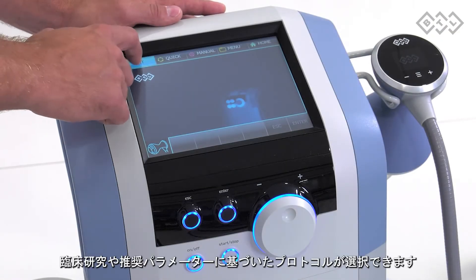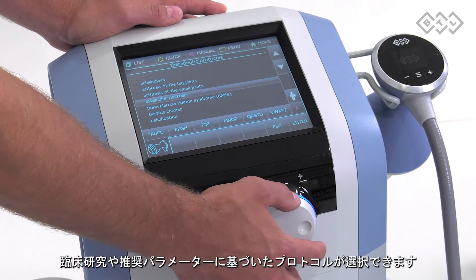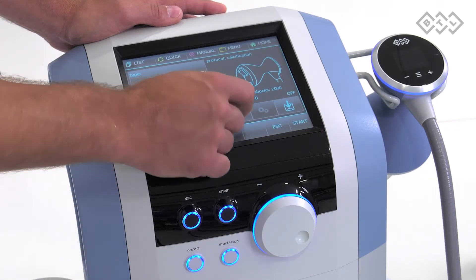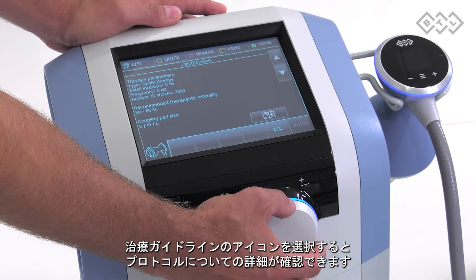We provide you with a set of presets which were created based on the available scientific research and recommended parameters. Choose the most suitable preset according to the patient's condition. Find out more about presets by clicking on the icon of the Therapeutic Encyclopedia.